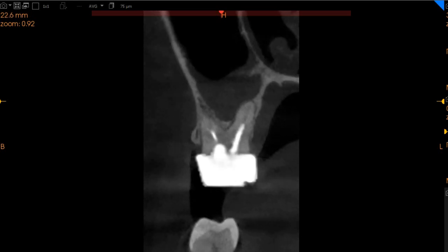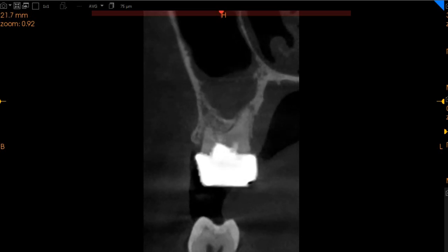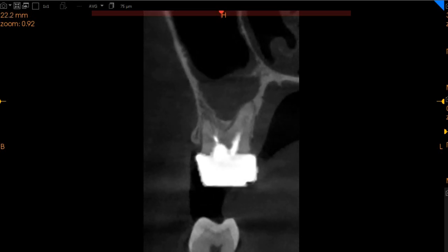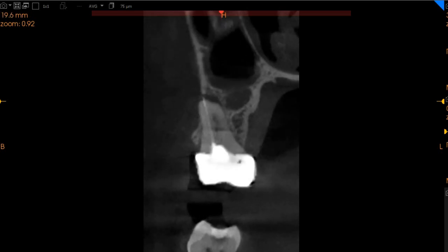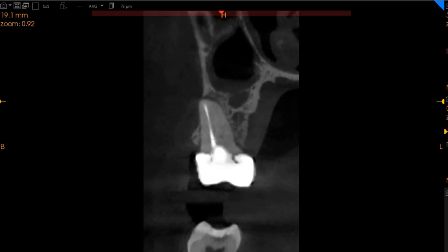Hello and assalamu alaikum. Ultra Scan Diagnostics here. This is the CBCT of the patient which you had requested. The area of interest is the upper right six.